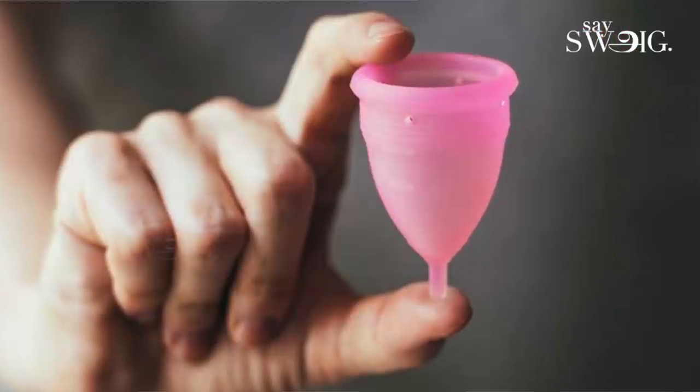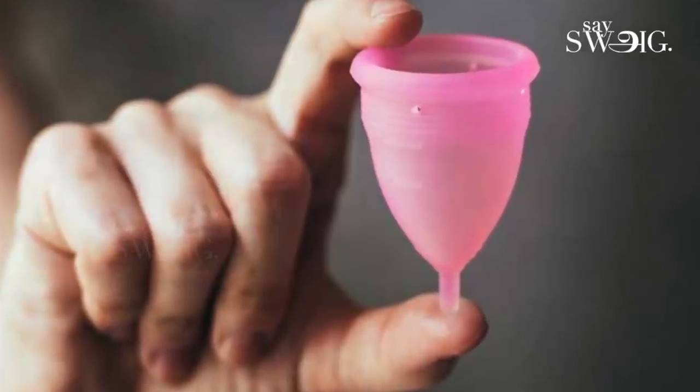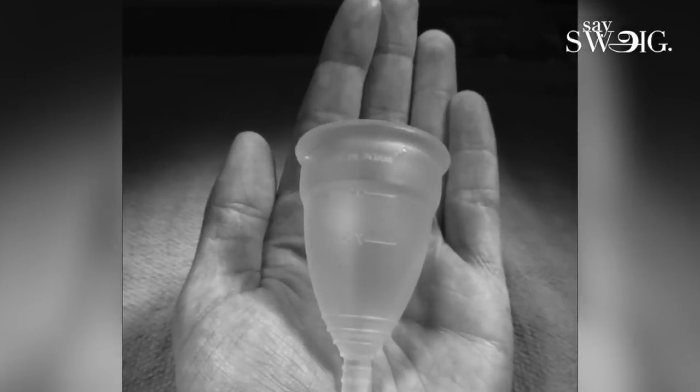So this is a menstrual cup. Obviously, it's a cup shape. It's available for you. It's mostly silicone-based, usually non-allergic. That material is washable and reusable.